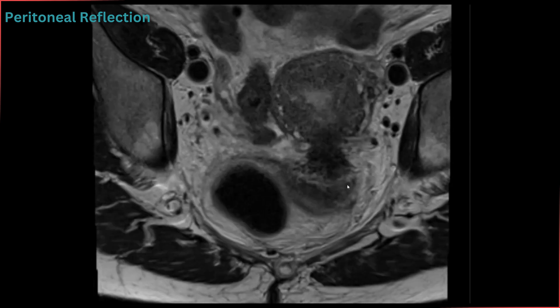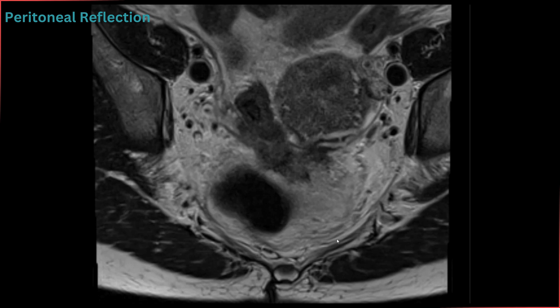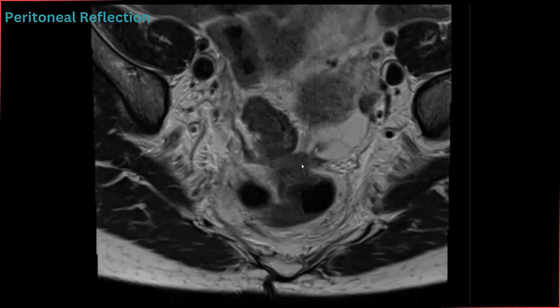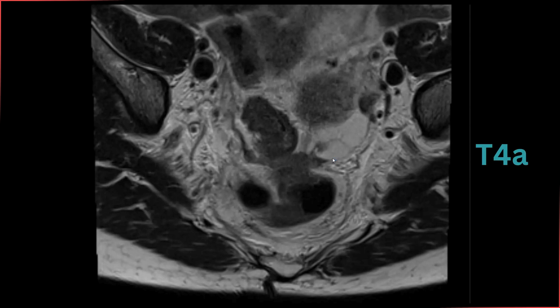This is the uterus, and this is the rectum. In the upper rectum, this whole area with irregular margins and thickening is the tumor. This band-like structure hanging into the pelvis is the peritoneal reflection, and you can see the tumor is clearly infiltrating into this reflection. This makes it T4A disease.